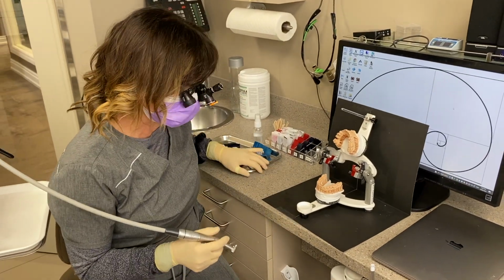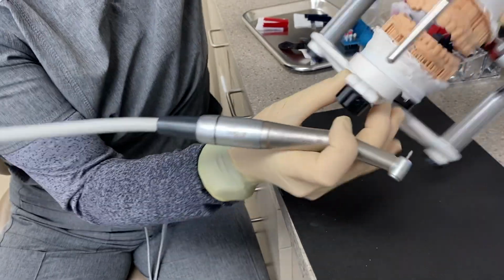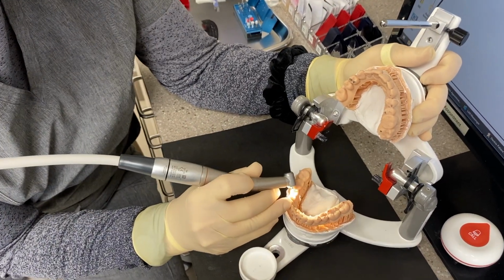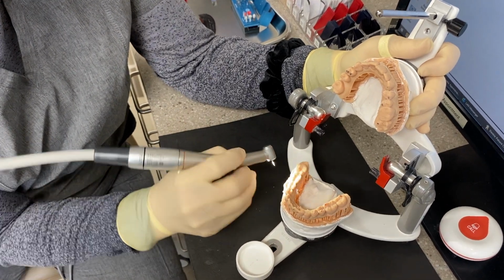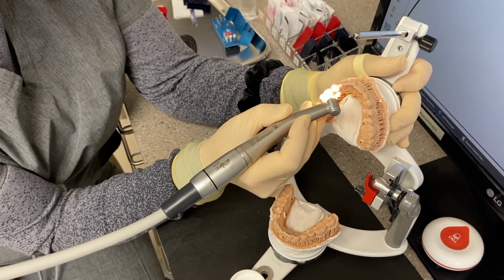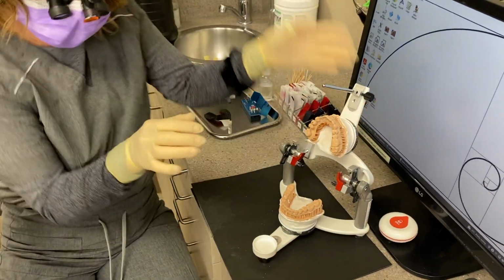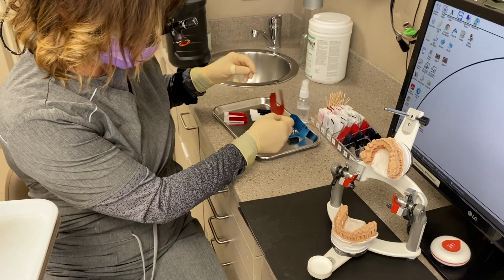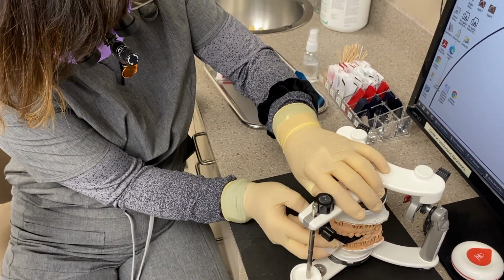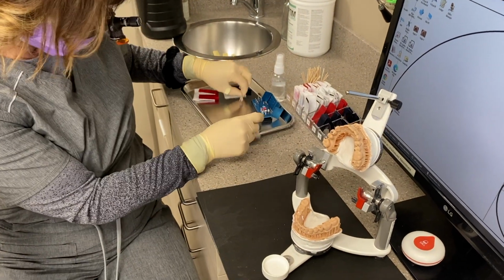Okay, so in this part, I'm just going to simply adjust the prematurities and then recheck again. In this case, the prematurity is on the incline of the buccal cusp, got down a bit. And it's also on the palatal incline of the upper cusp. So we're going to leave the other contacts in for now. I'll probably end up adjusting more because this tooth is quite heavily in occlusion. And then just recheck it again. So mark it up, and check with shim stock.